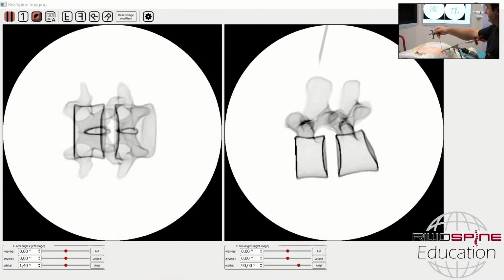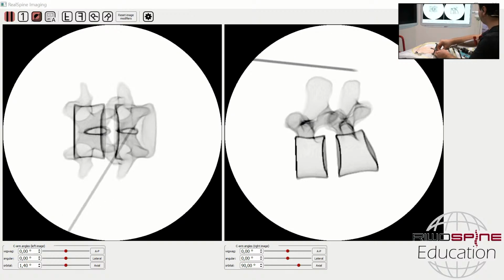But again, the lateral lines. Now in this case for the L5S1, you have to take care about the iliac crest. If you choose really far lateral, then you can block with the iliac crest. Then you can choose more posterolateral approach here for the L5S1 level, and then you have to take care about the iliac crest not to hit, and you can choose the line like this oblique to the extraforaminal area.